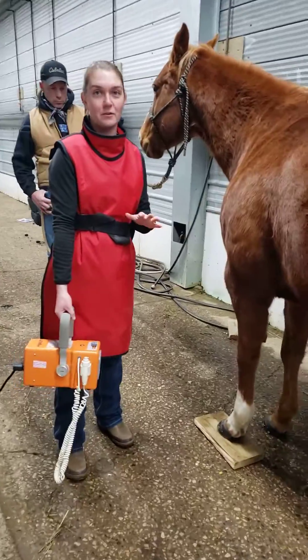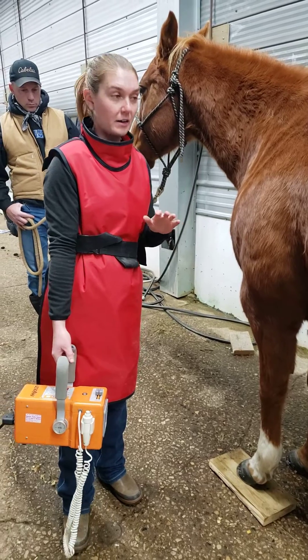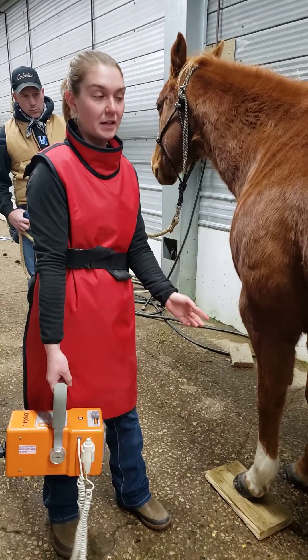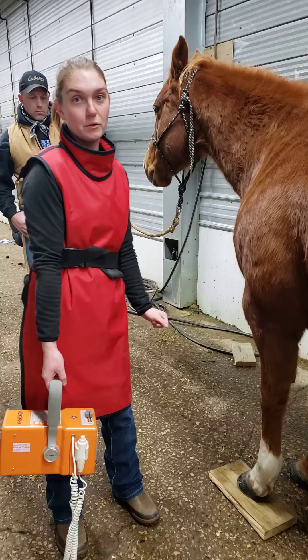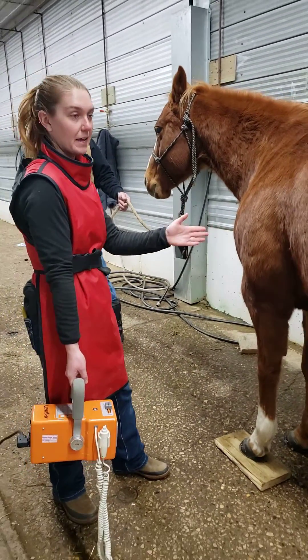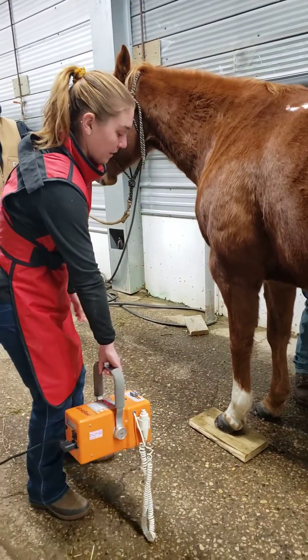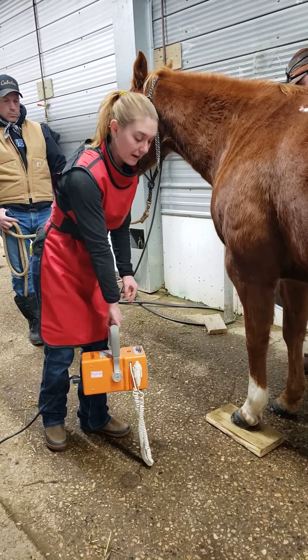When first looking at a hoof, there are two basic views that you need to have, basically because you're looking at a 2D photo of a 3D object. The first one is your lateral view, so you're looking from the side of the horse going through. When you take that view, you have to be at exactly the right angle to the horse — in alignment with the leg and the hoof. If you're up at an angle, it'll distort how your hoof looks on your radiograph.